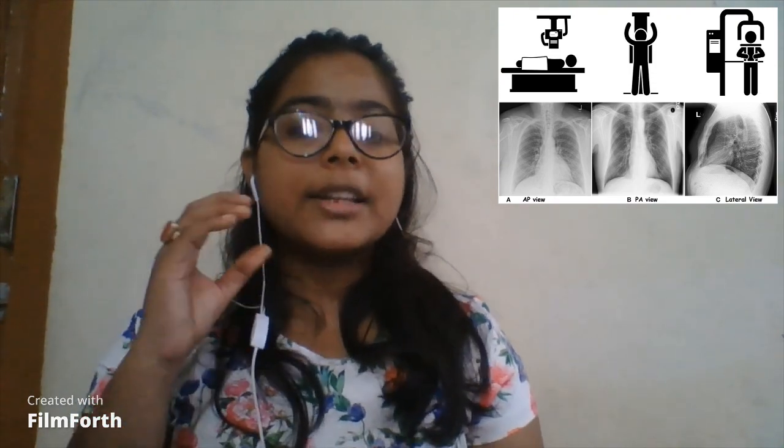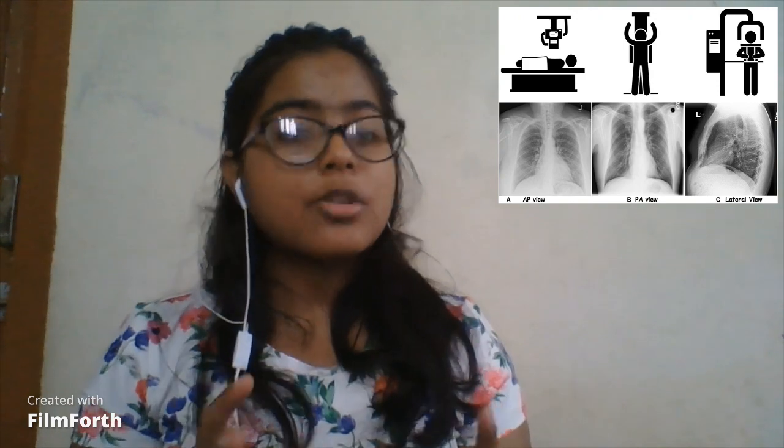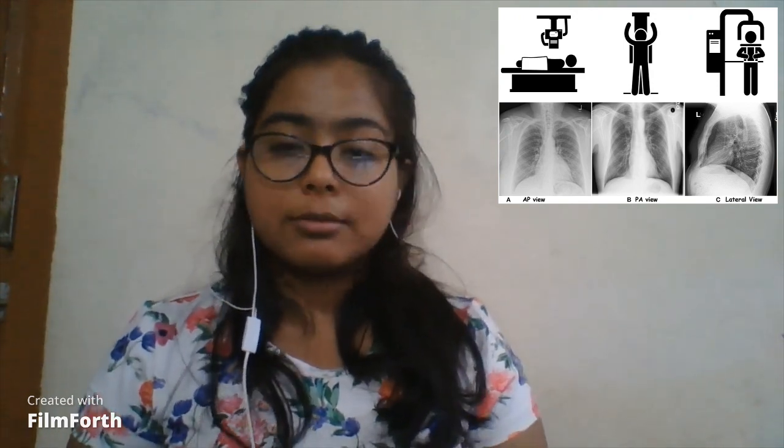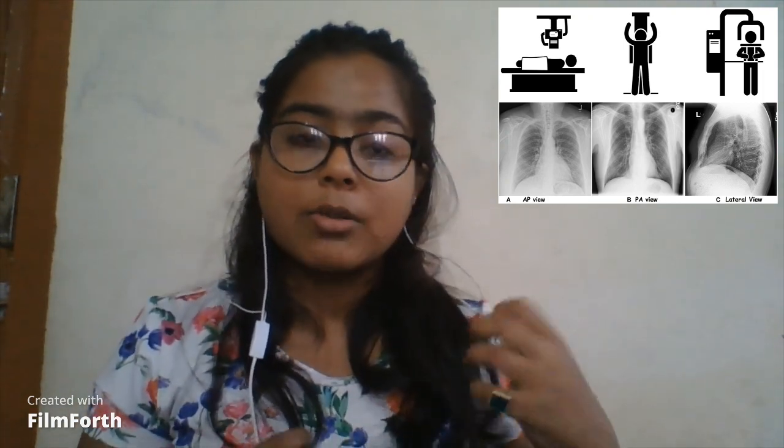For example, when the shadow of the hand is cast on the wall and we move further away from the wall, the bigger the size of the shadow gets. And the same happens with X-ray images, because in the case of posterior anterior images, the film is located in the front and it is closer to any organ that is present, especially the heart. So the closer it is to the film, the truer and more accurate, or we can say the more focused the size is going to be, which is helpful while diagnosing a disease or checking a patient's health. X-rays are very two-dimensional in nature because they only give the length or the width of the lungs.